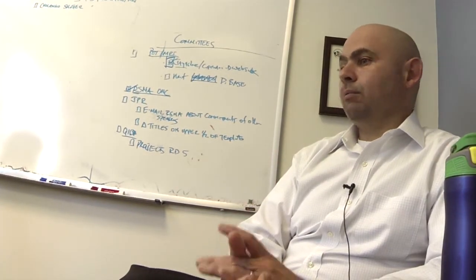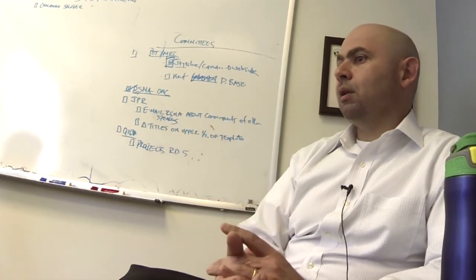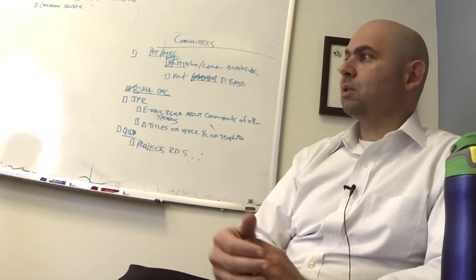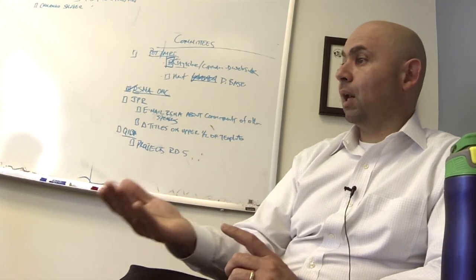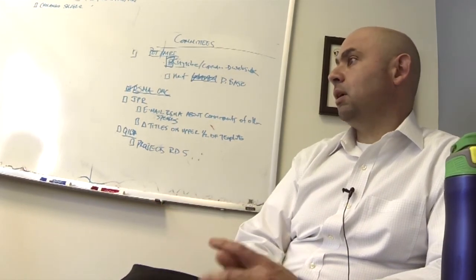As you get more and more versed in MR parlance, you get comfortable with what normally is a T1 weighted image versus a T2 weighted image, and the things that are normally short, that have short T1s, like blood, like fat, and things like that.